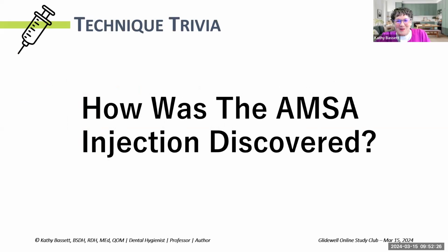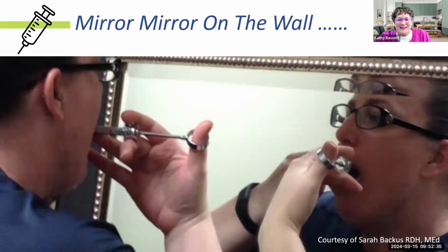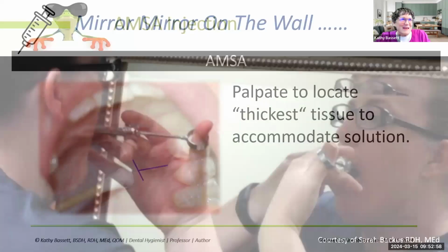So the first thing, just to throw a little bit of trivia: do any of you know how the AMSA injection was discovered or crafted? And I love this because Dr. Mark Hochman, who is the patent holder on the wand, and the group of people that initially started that group of CompuDent technology, they actually worked this injection I'm going to show you out on themselves. And this is one of two friends of mine that actually will go and do their own injections for their own dentistry. And I assure you that is not me.